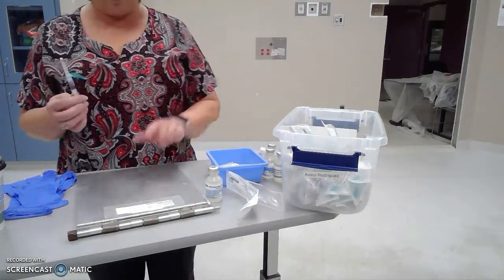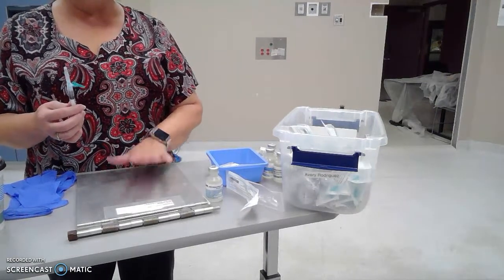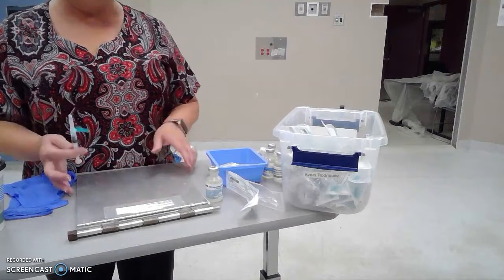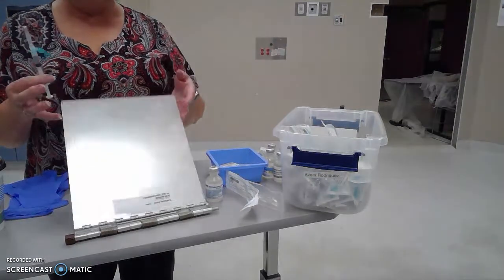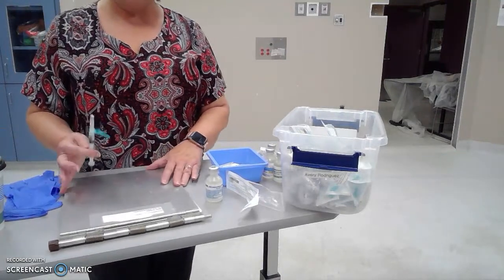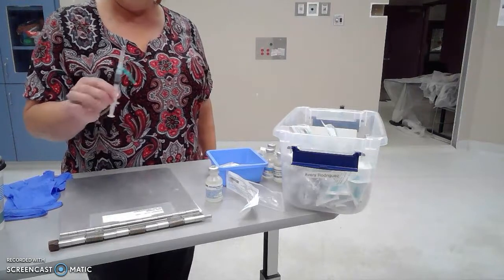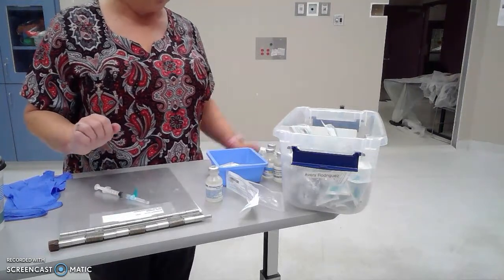Now you're going to be doing all your checks to make sure you have your right patient, your right time, your right route, your right date of birth, no allergies, all of those things. But for the sake of time for this video, I am not doing all those checks, but you will have 3 places you do all the checks. So now I have my medication ready to go to my patient's room.